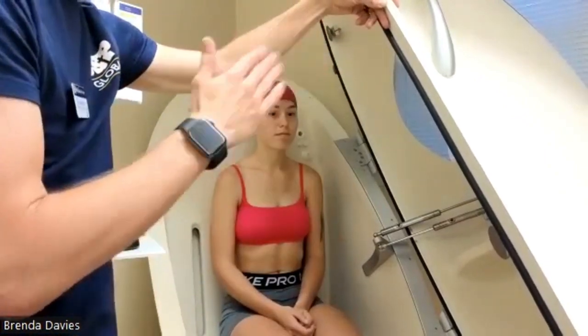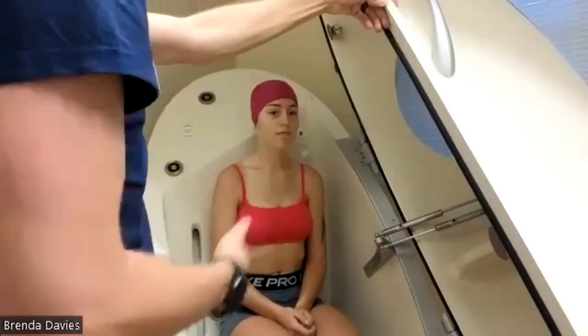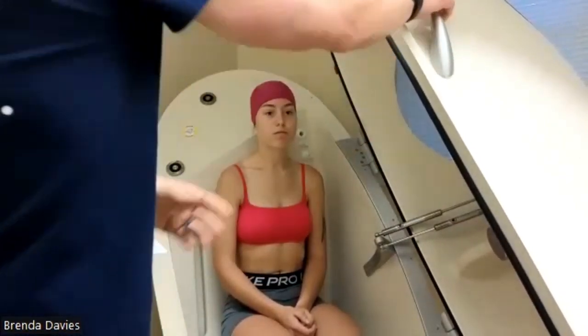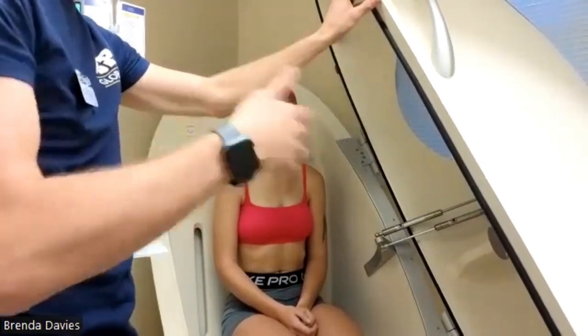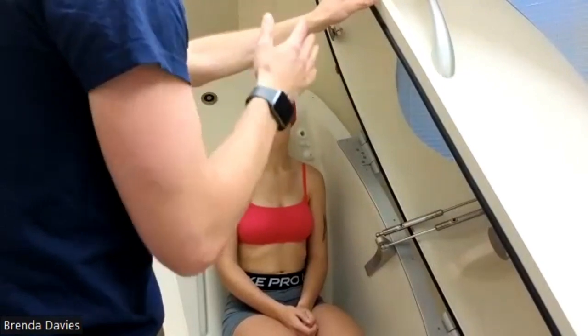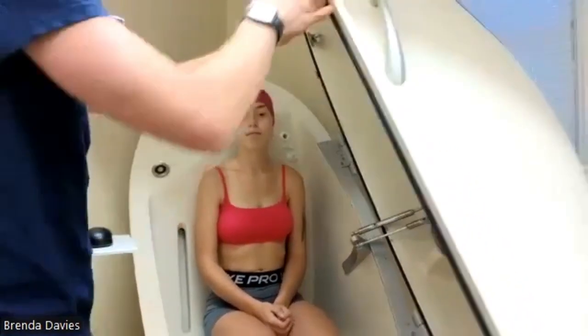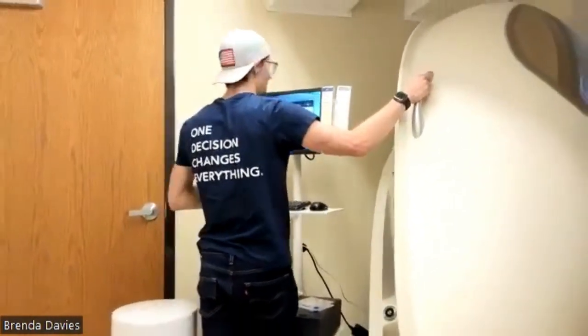There's a membrane that will change that pressure that will then give us a volume that we can determine for Anna. So we're going to do that at least twice. Make sure that there is a consistent measure between those two. If it's inconsistent, we'll do a third measure, but each time it's about 45 seconds. So yeah, just breathe normal, try to limit your movement and relax as much as possible.